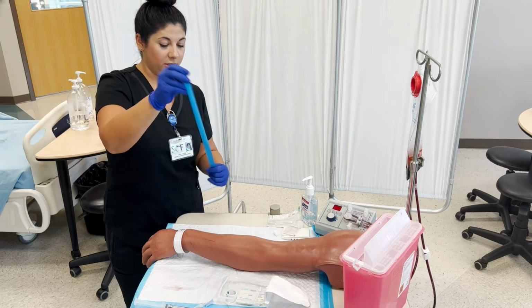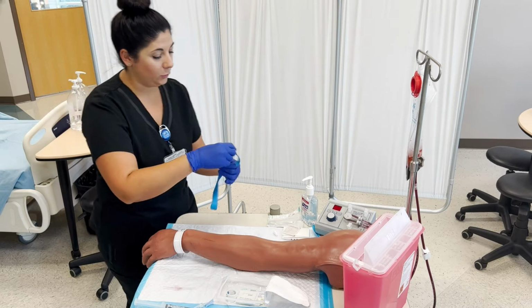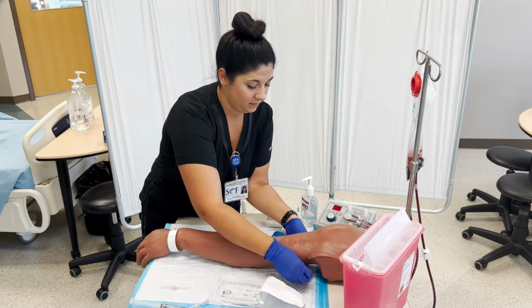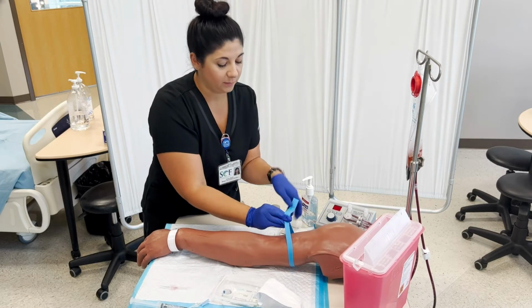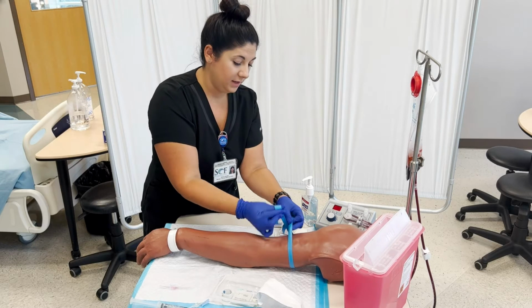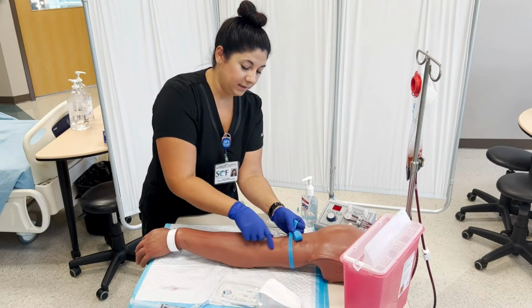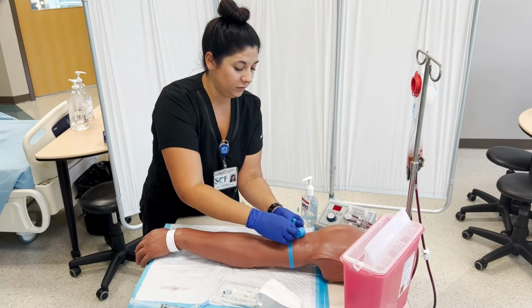I have my tourniquet. I like to stretch it out a little bit when I first open them. Go ahead and put that on his upper arm. You want it to be about 4 to 6 inches above where you are planning on injecting or putting your needle into your patient. You don't want it to be right on his elbow or his wrist, so be careful of those joints.